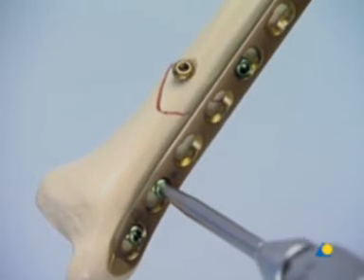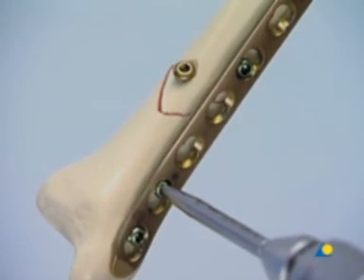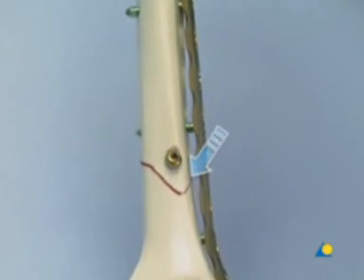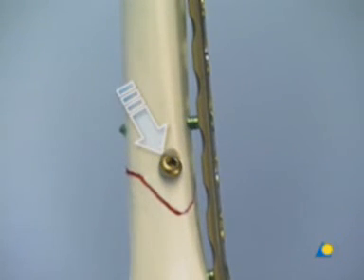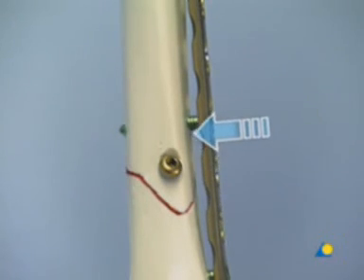To finish the fixation, one more locking head screw is introduced in the distal main fragment. A simple type A tibia fracture in the distal metaphysis has been anatomically reduced and fixed by an independent lag screw, protected by an LCP applied as a purely internal fixator. In the area of the fracture, the plate does not interfere with the periosteal blood supply, since it's not pressed against the bone surface.